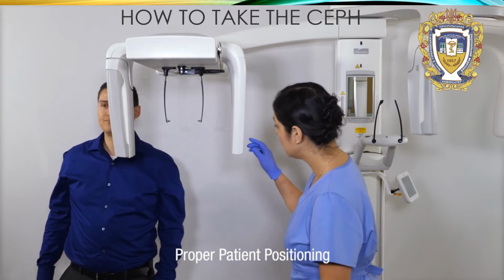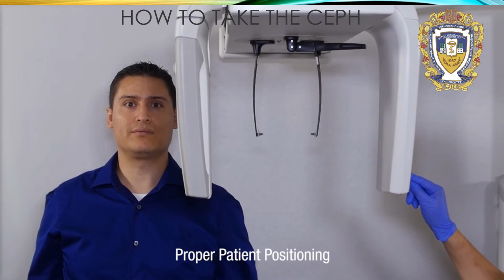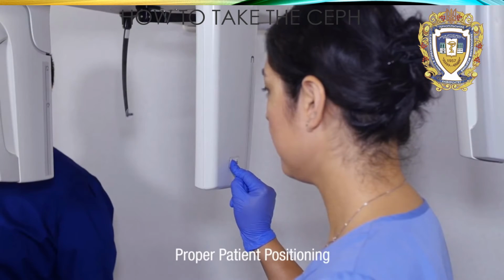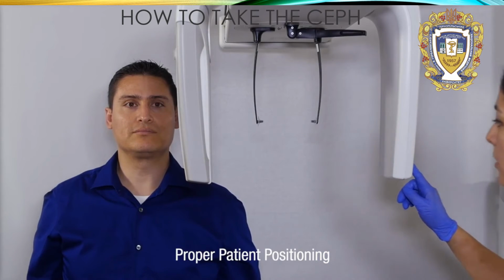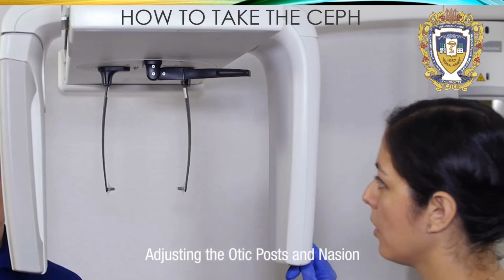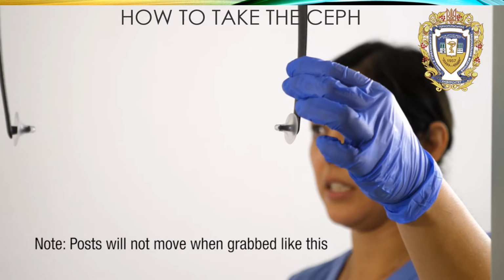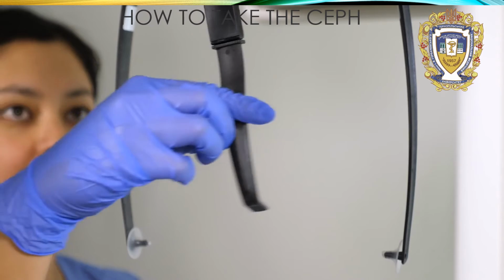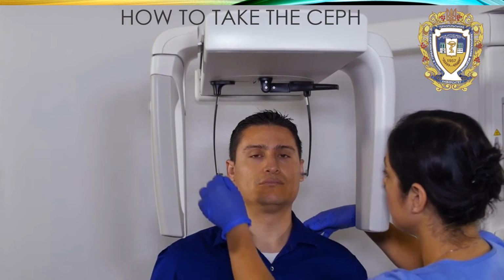With the patient standing next to the unit, visually compare the height of the patient's otic canal with the cephalostat ear posts. Adjust the height of the cephalostat until the ear posts are approximately the height of the patient's otic canal. Grasp the otic posts at the top and move them out to position the patient. The posts are designed so that they will not move except when grasped at the top. Next, rotate the Nasion marker up and help the patient to enter the unit.